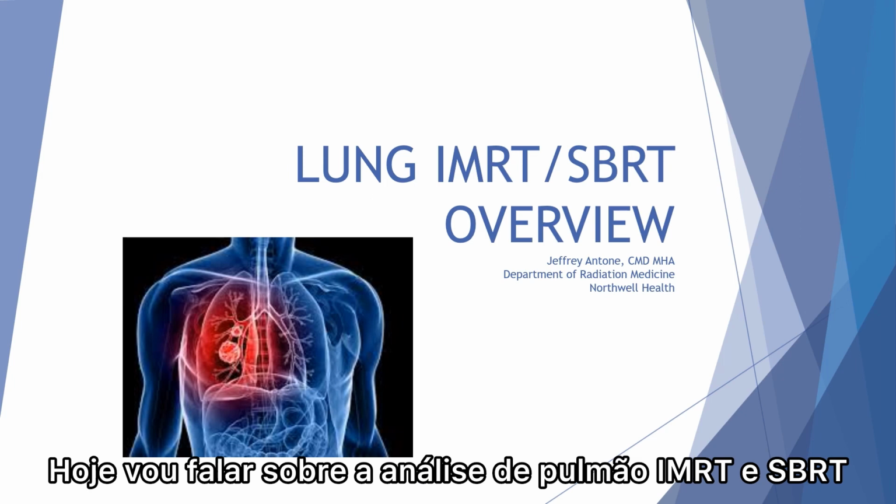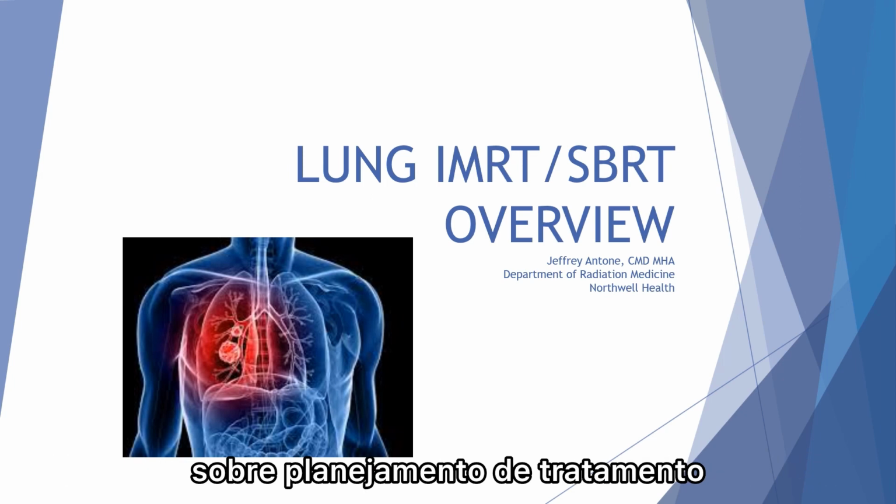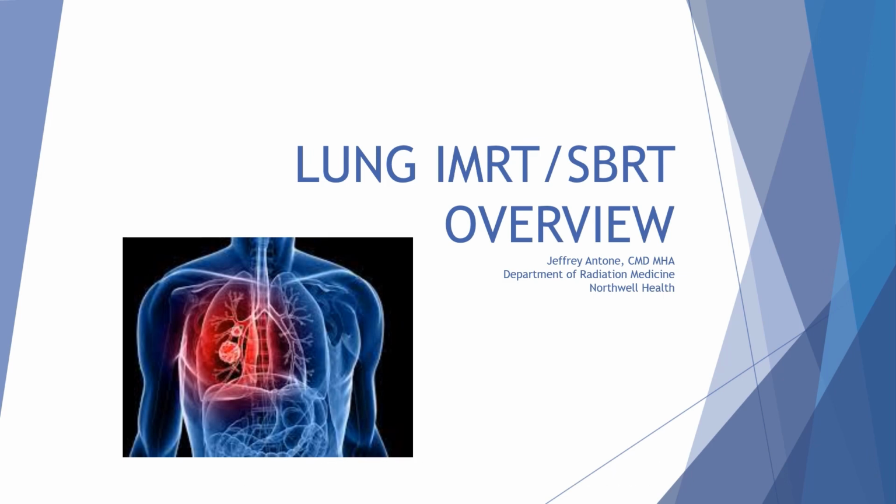Today I'm going to be going over a lung IMRT and SBRT overview, with treatment planning tips and tricks that we can use in the clinic.